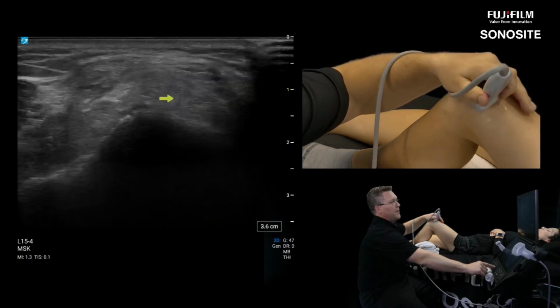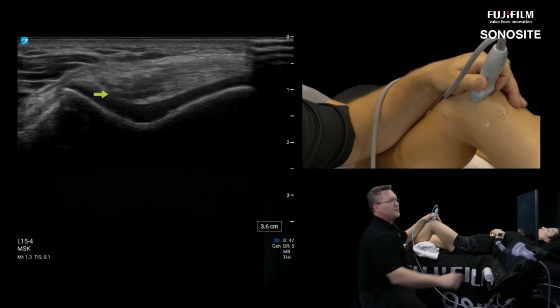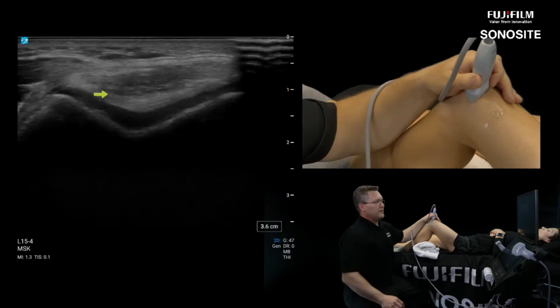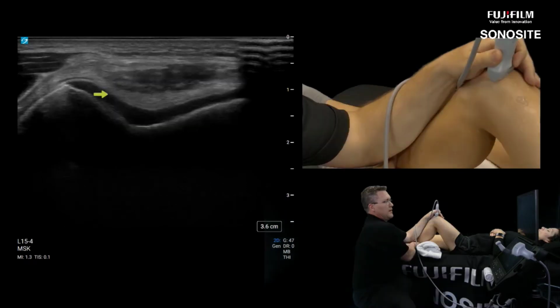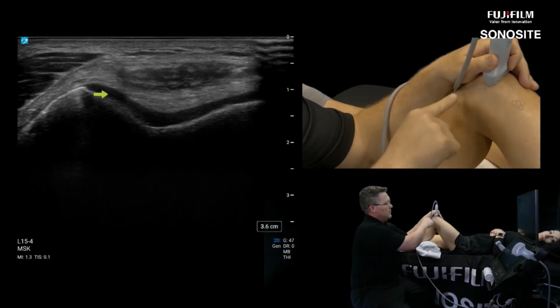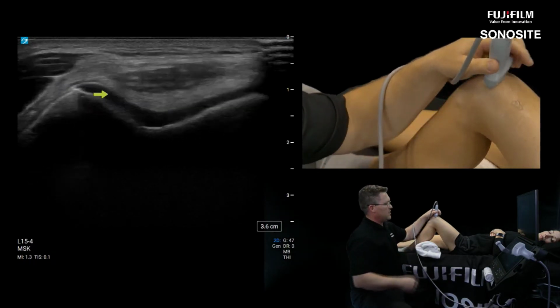So I'm going to go back over to the main quadriceps, right over the distal femoral trochlea, and this looks like that sunrise view that you get in radiography. And we can keep evaluating that proximally and distally. If we wanted to evaluate more of it, we could put the knee into a little bit more flexion. And any further distal, I'll show you a cool trick in the infrapatellar exam. We can further evaluate the rest of the anterior part of the trochlea on the infrapatellar view when we straighten the knee, and we'll go over that in just a minute.